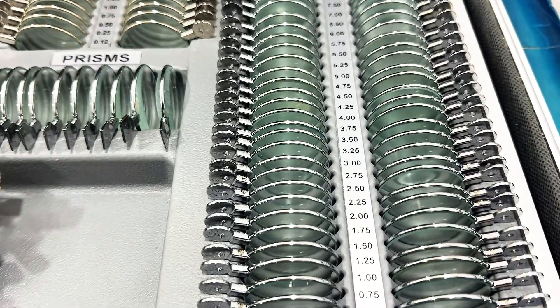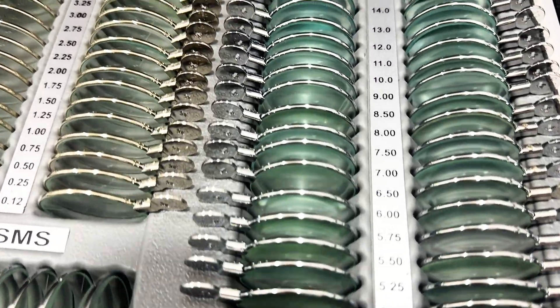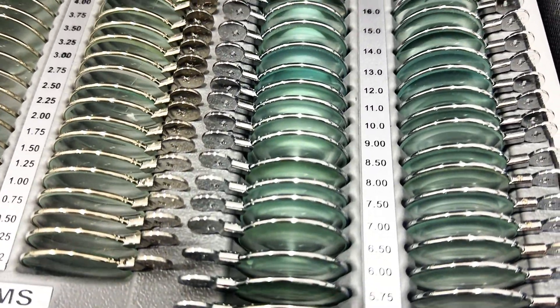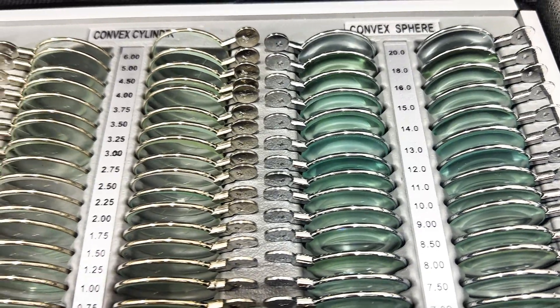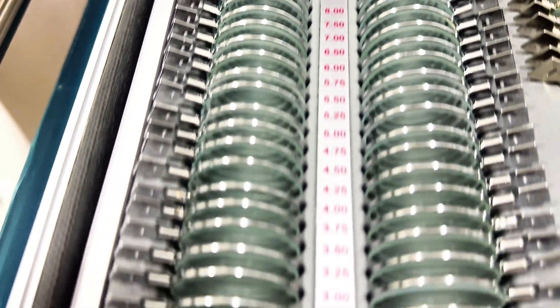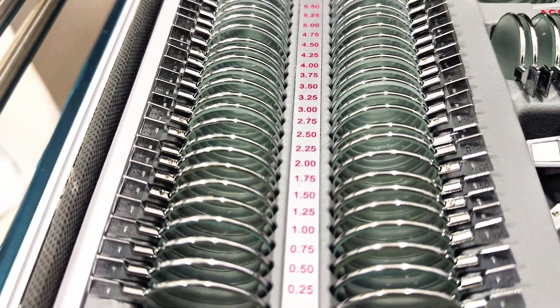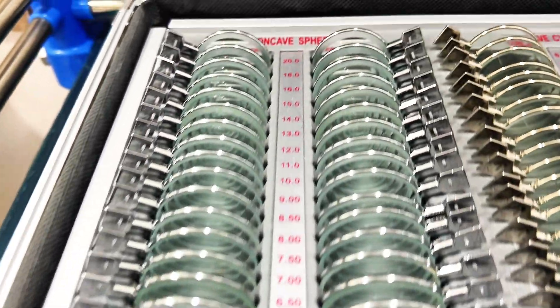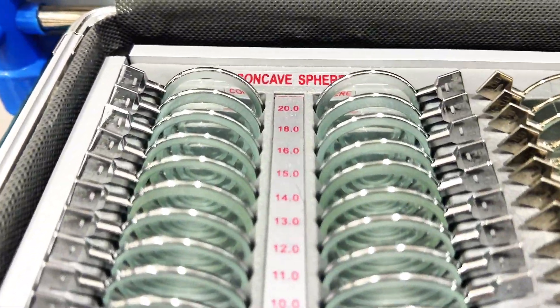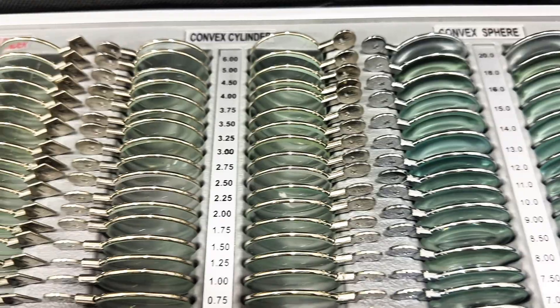The plus lenses are found on the right side of the box and they usually range from +0.25 diopters up to +20 diopters in most sets. The minus lenses are found on the left side of the box and they usually range from -0.25 up to -20 diopters in most sets as well.